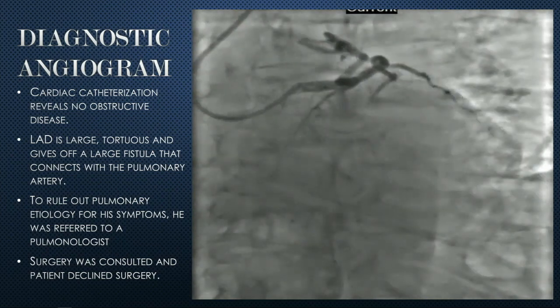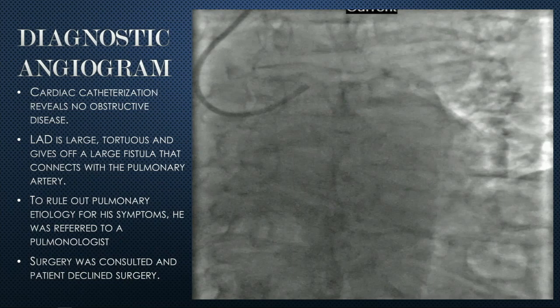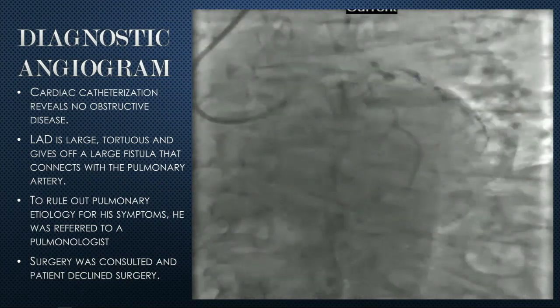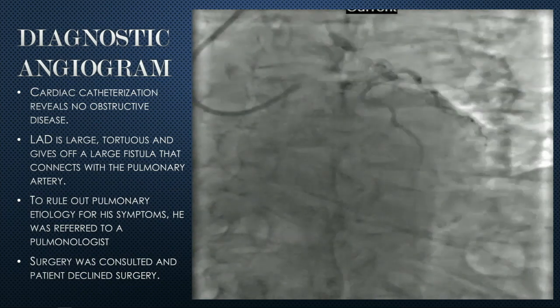Our diagnostic angiogram revealed no significant obstructive coronary artery disease. However, we did find, connecting the proximal LAD to the pulmonary artery, a large fistula.